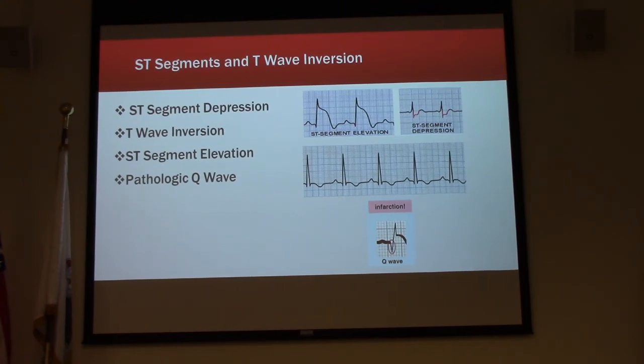Okay. Then we're looking at ST segment elevation. ST segment elevation means injury, means we've got to do something right now to get this heart perfusing or it is going to die. The muscle itself is going to start to die. Again, aspirin, nitro, morphine, getting them to a cath lab as soon as possible can help save some of that. Right now it's just injured, but we can fix injury.